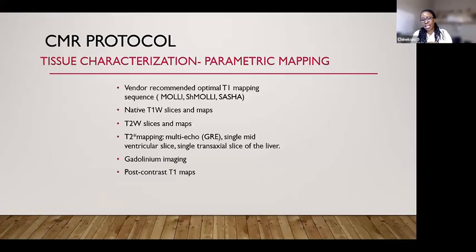If it is healthy myocardium, there's a predictable wash-in and wash-out time. Therefore, at a specific stage of imaging after the infusion has gone in, we expect the myocardium to be filled with gadolinium. At another time point, we expect the myocardium to not have gadolinium. If it's healthy, it should have washed out of it, and it will probably be in the venous system going into the rest of the second pass perfusion through the body.